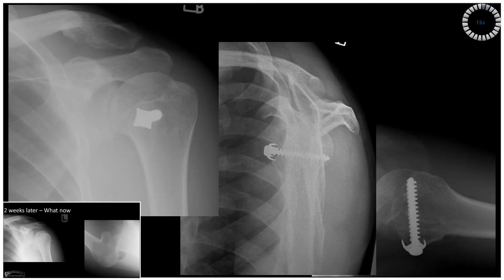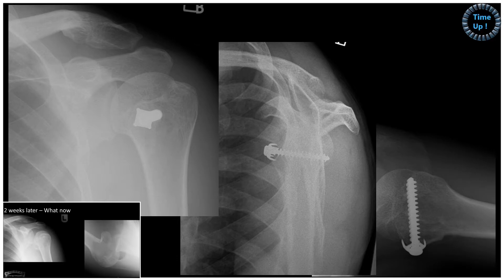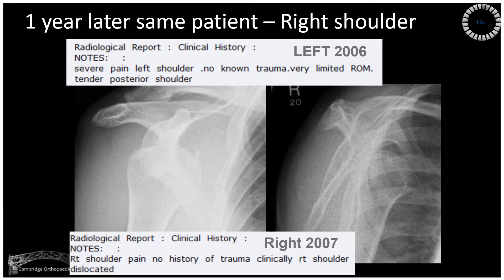In true AO fashion, approach the radiographs with what went well and what could be done better or different next time. The patient presents a year later and wakes with pain in the right shoulder. Note how similar the histories are. What is happening to this patient?